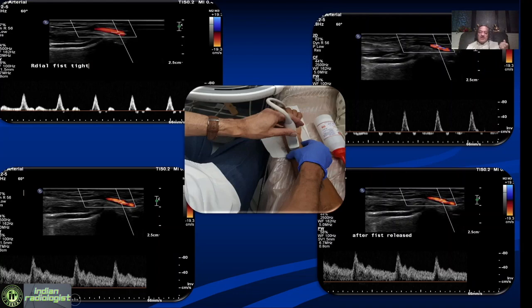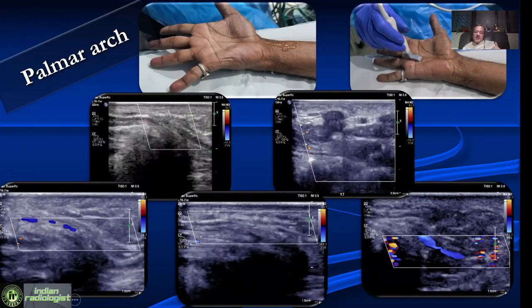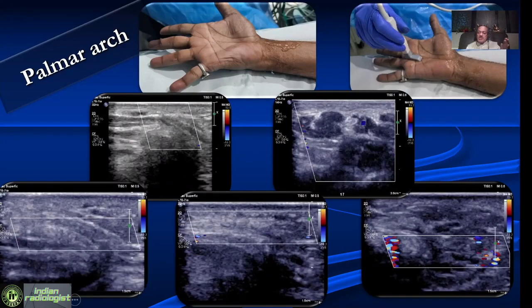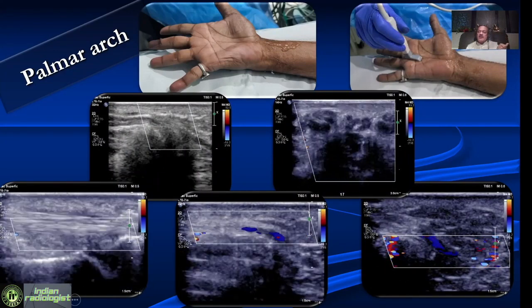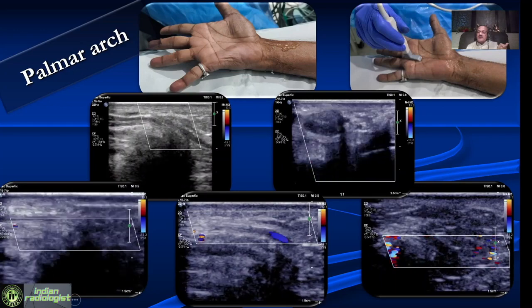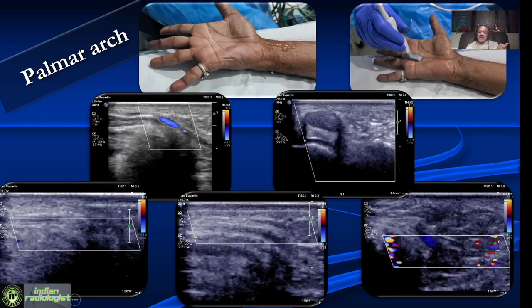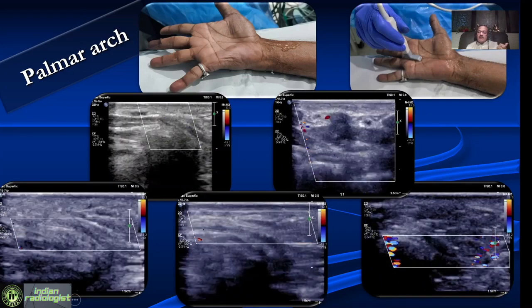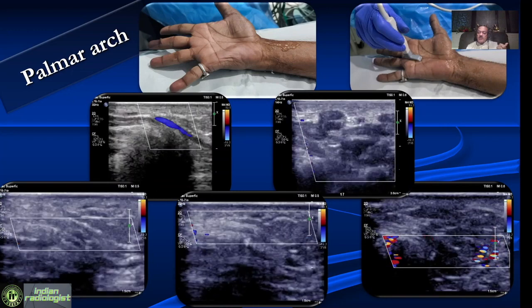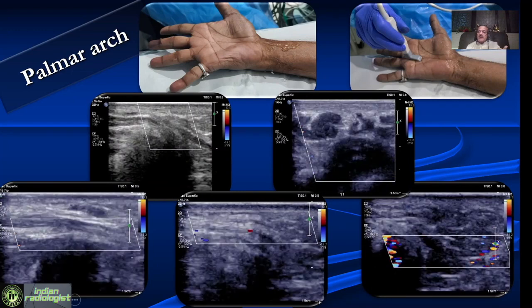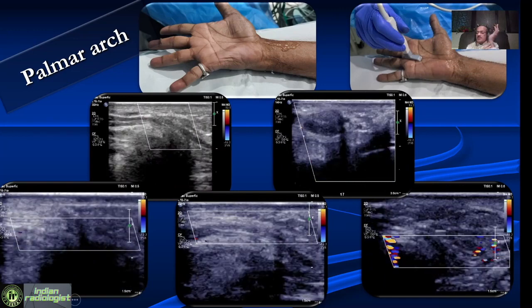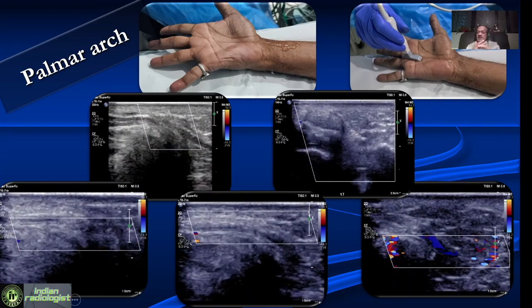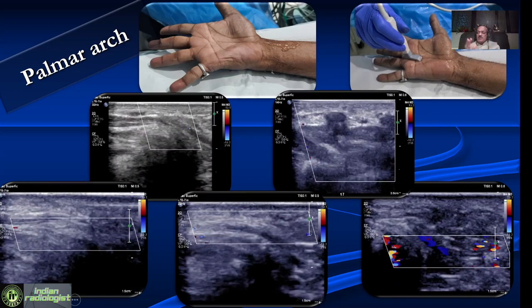We can also look at the palmar arch and the flow in the digital arteries. We do this typically when the patient is suspected to have small artery disease — for example, if everything is fine up to the radial and ulnar artery but the patient still has symptoms, that is the time to start looking at small arteries in the palm or in the fingers.